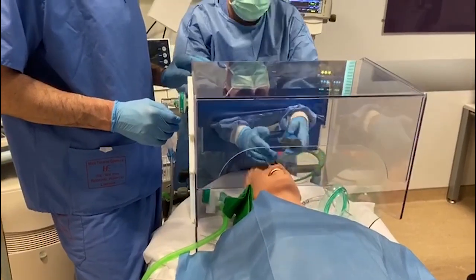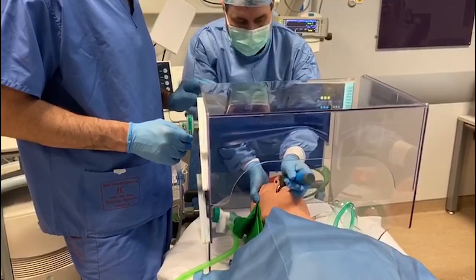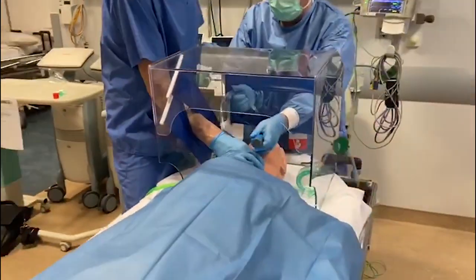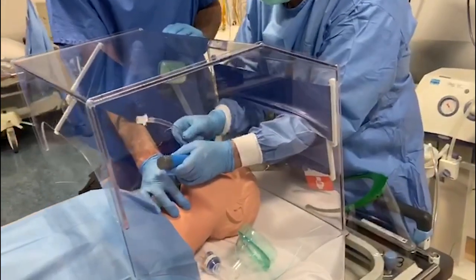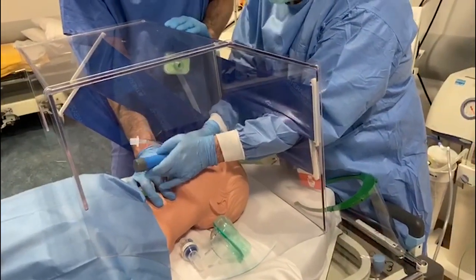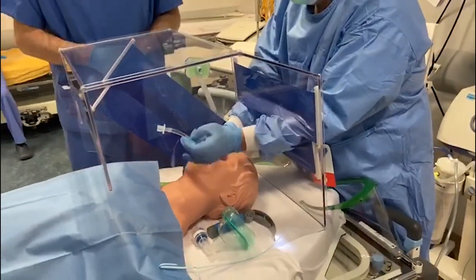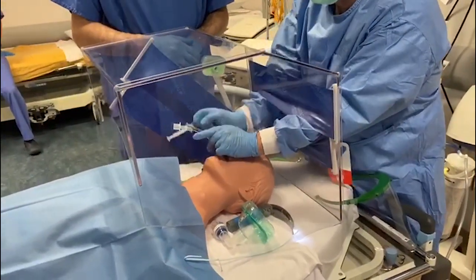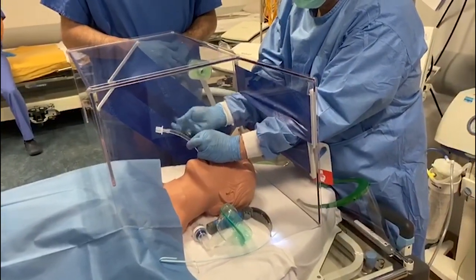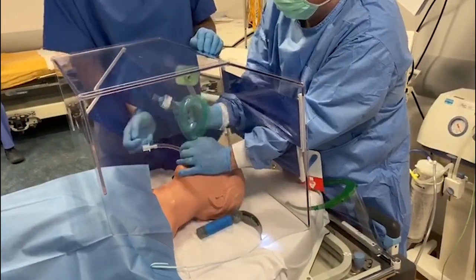Even without a videolaryngoscope here, I've got quite a good view of the larynx, and I am well able to intubate quite easily, allowing for the fact that the mannequin is rubber. And then we can inflate and attach our circuit.